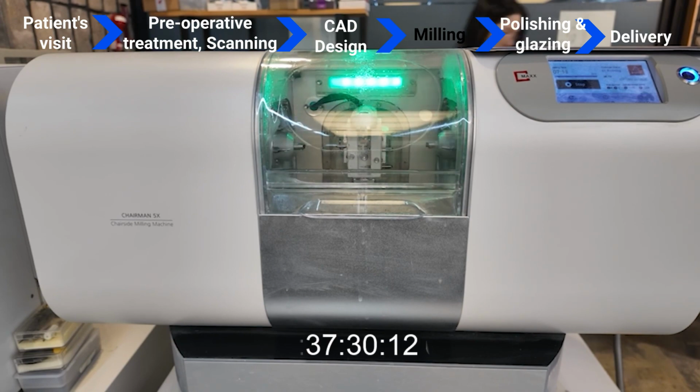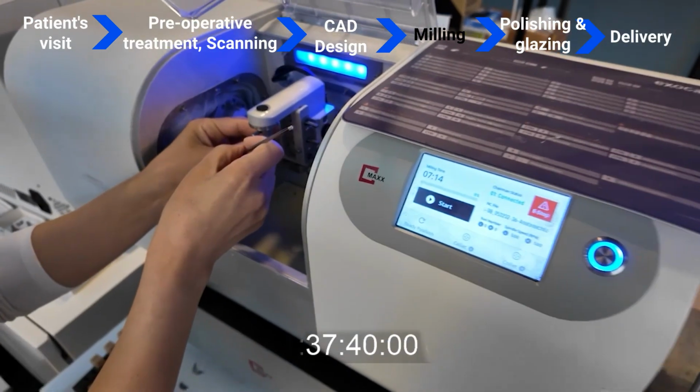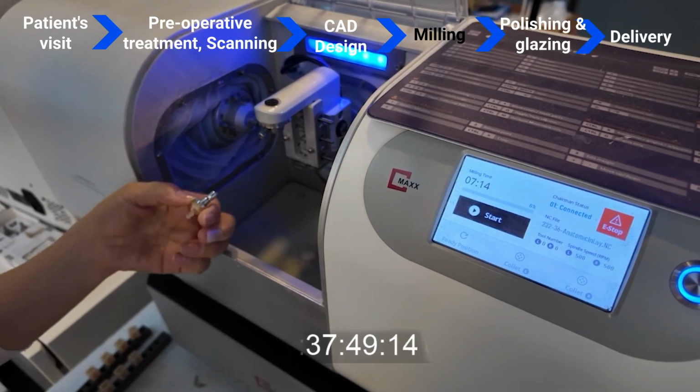Once milled, we remove the inlay, cut off the connectors, and begin polishing.